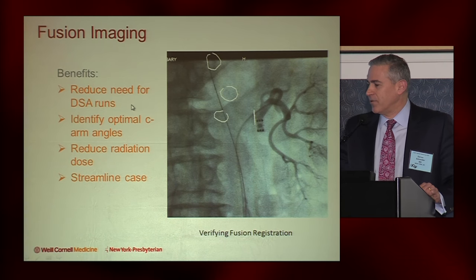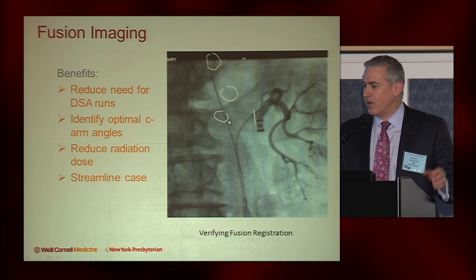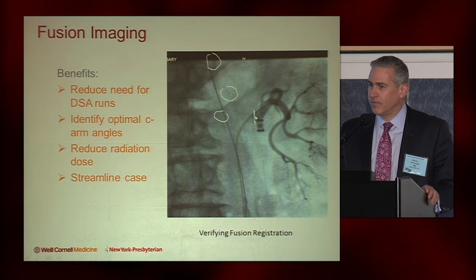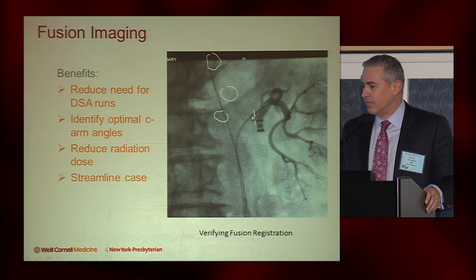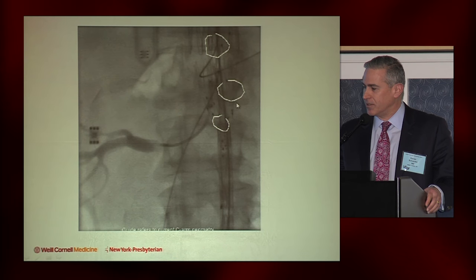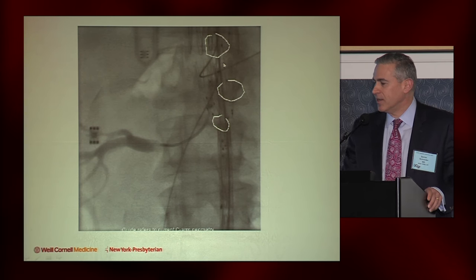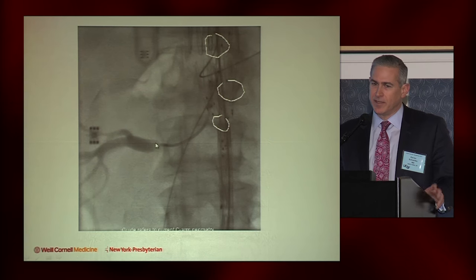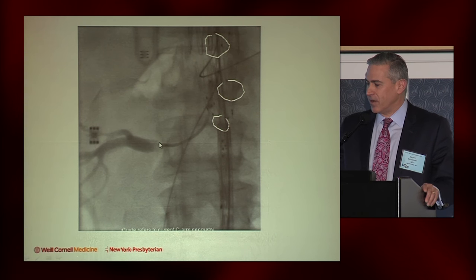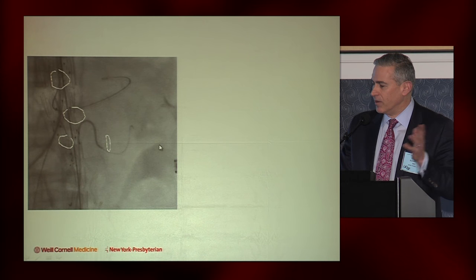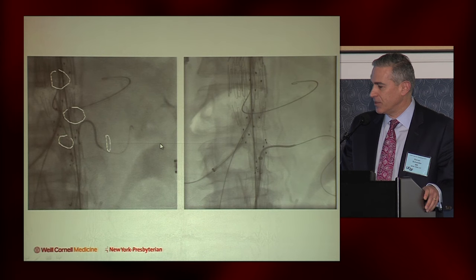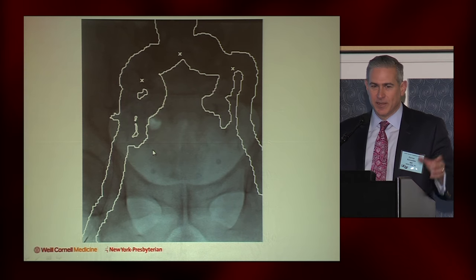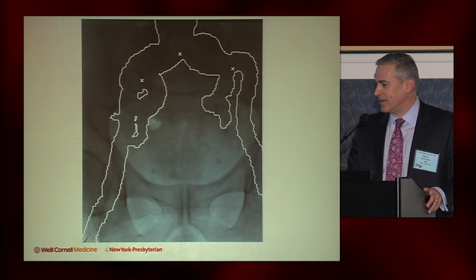We reduce the need for DSA runs. The other thing we can do is immediately know the optimal C-arm angles — once you get this ring perpendicular, you know you have the right alignment, so you don't have to do a bunch of angiography to get the right orientation for the vessel. All of that reduces radiation doses and streamlines these cases. Here you can see another example where we've already positioned our device — a four-vessel fenestrated device with a catheter coming through one of the fenestrations in the right renal artery. Again, no DSA to confirm we're there, just a little puff of contrast through our catheter. You can create more sophisticated overlays, though I actually don't like these because they present too much information on the screen and I think they get in the way.